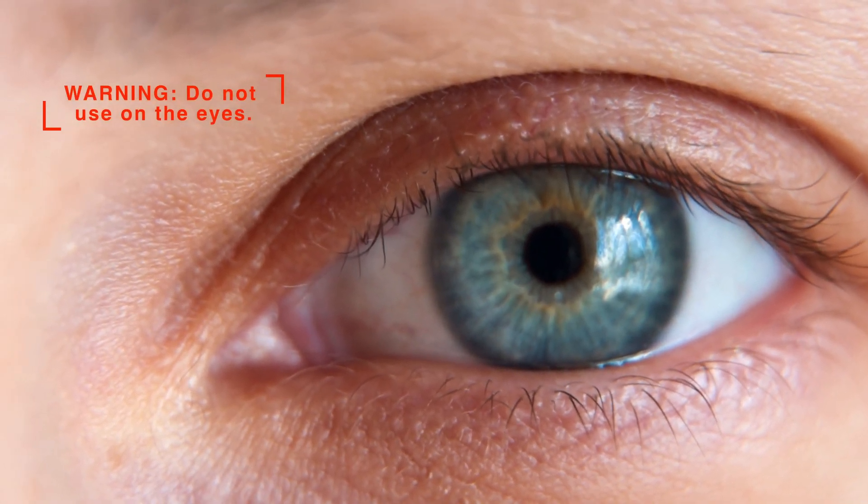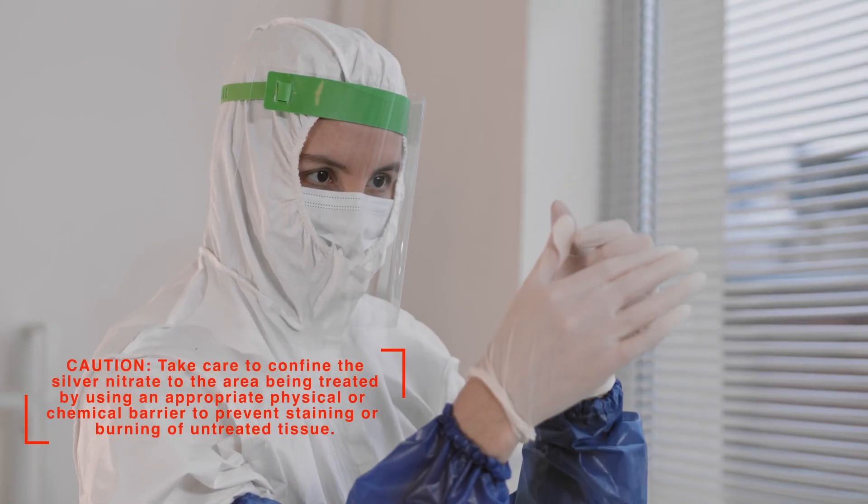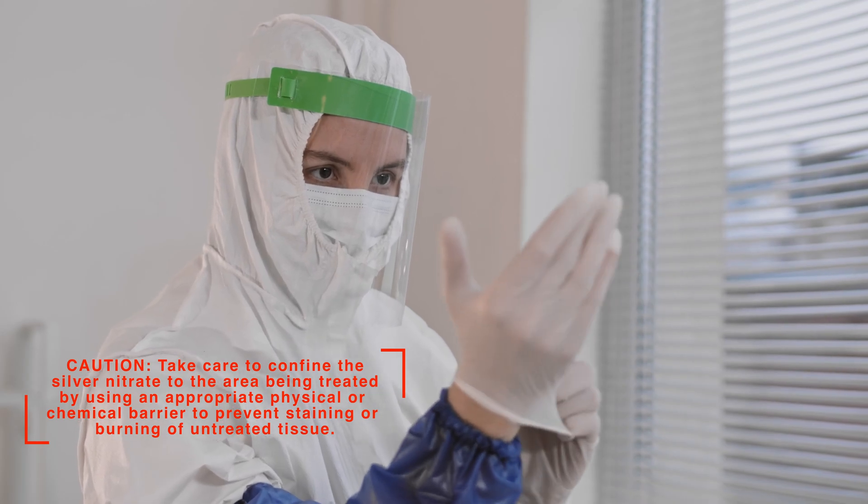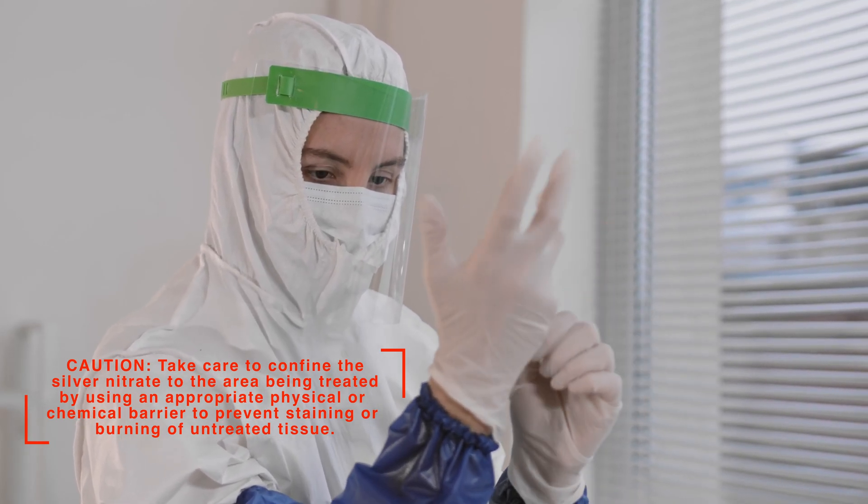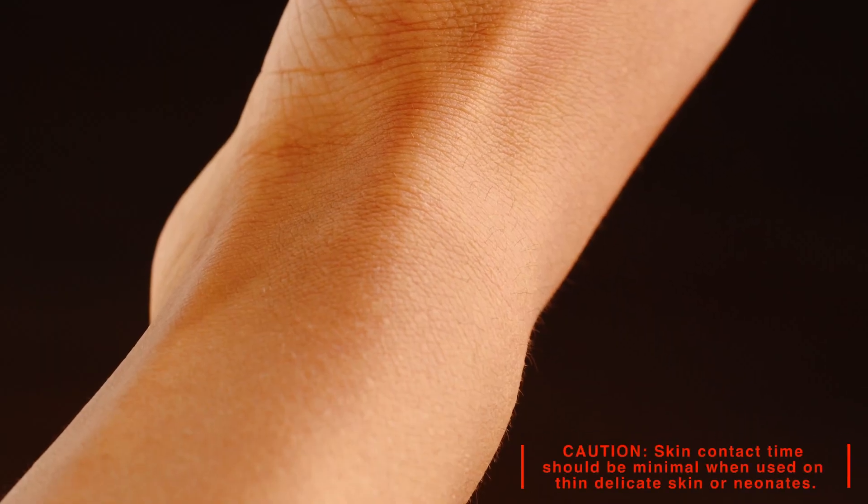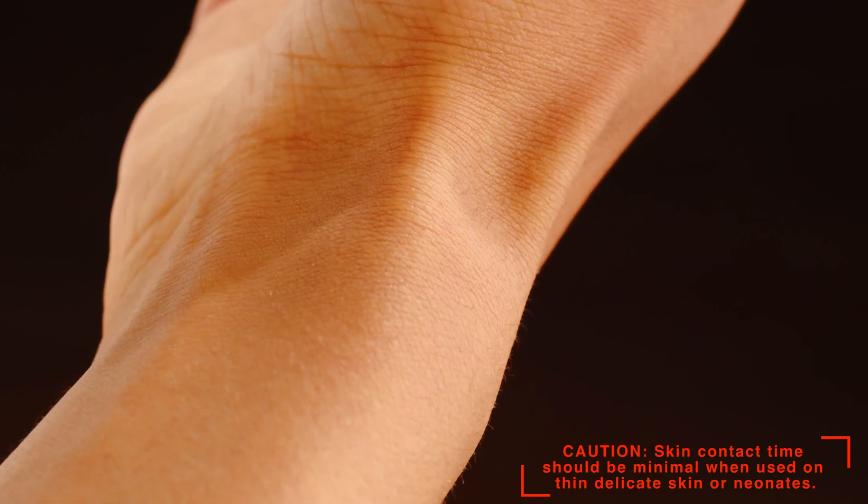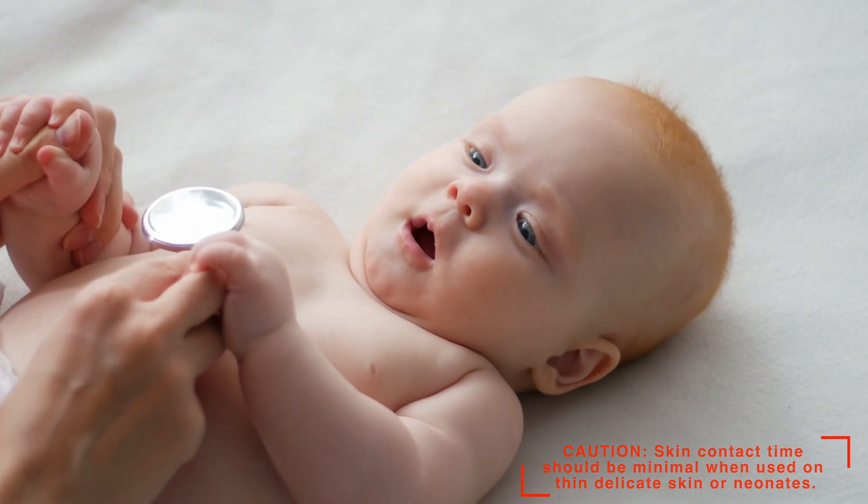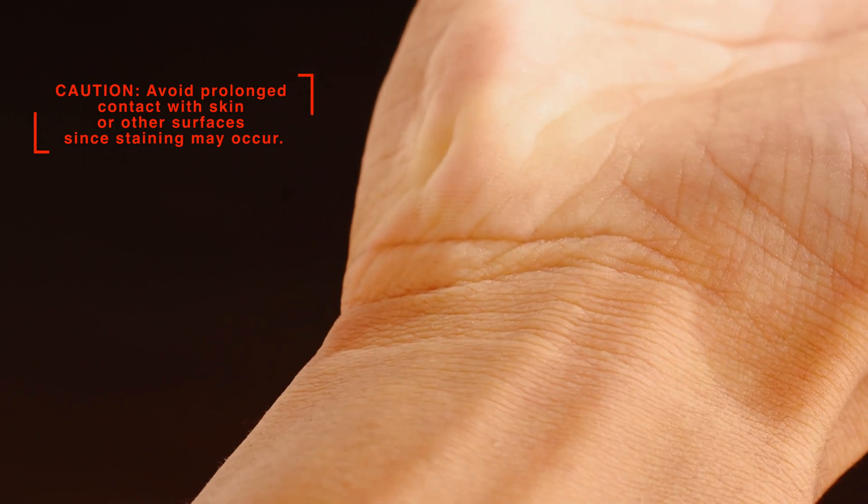Do not use applicators on the eyes. Use an appropriate physical or chemical barrier to prevent staining or burning of untreated tissue. Minimize skin contact time on thin, delicate skin or neonates. Avoid prolonged contact to prevent staining.